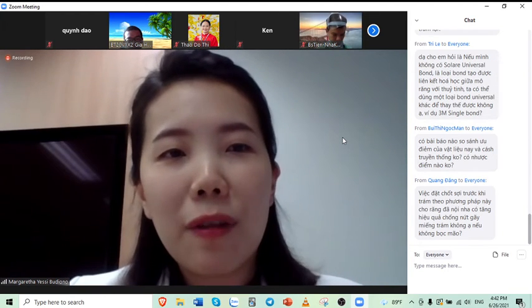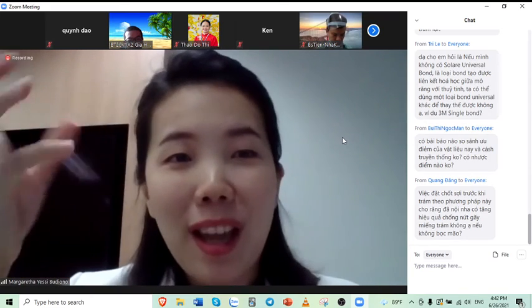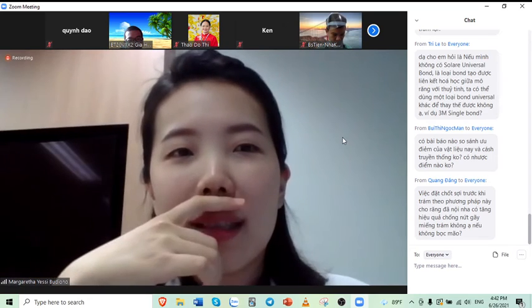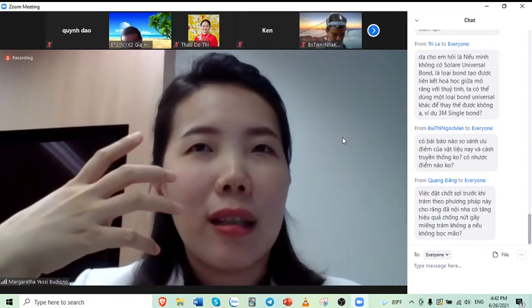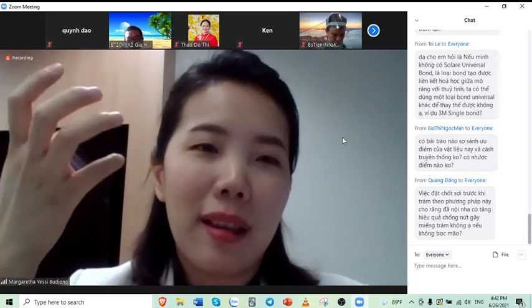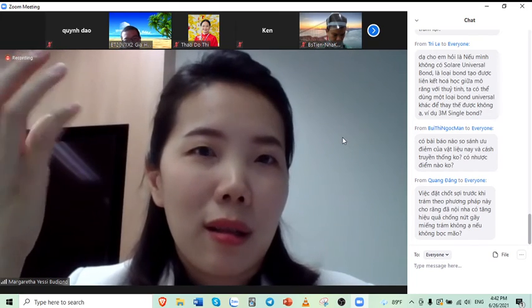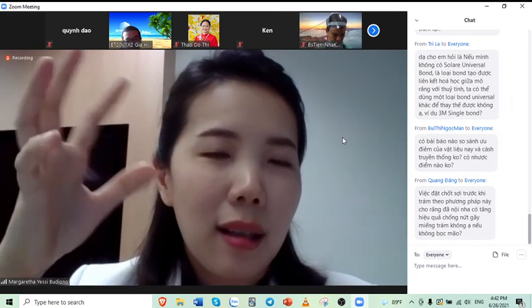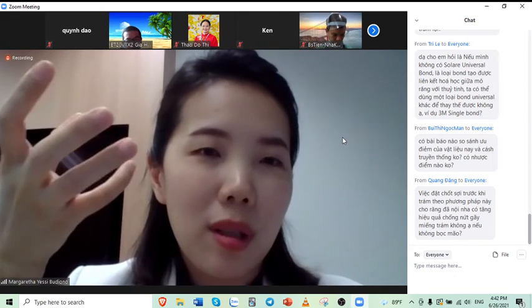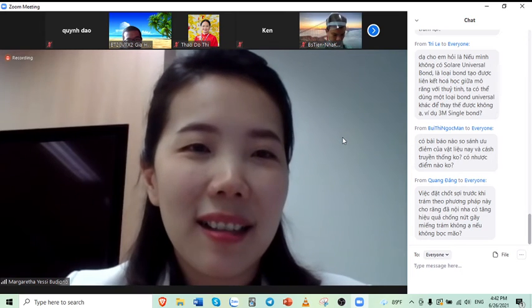Some dentists might feel safer having a post to increase the retention of the top restoration, but some dentists might feel that a fiber post doesn't necessarily help with retention, and they prefer not to use this fiber post system. So it really depends on the dentist, I think.